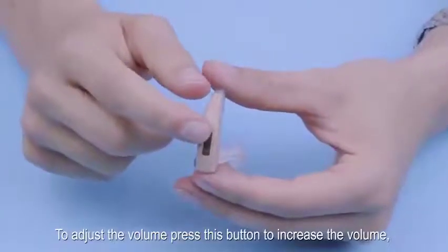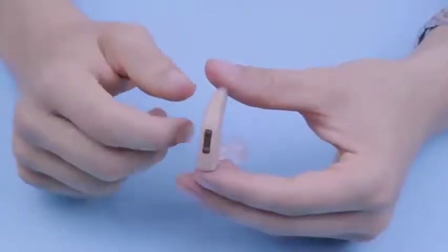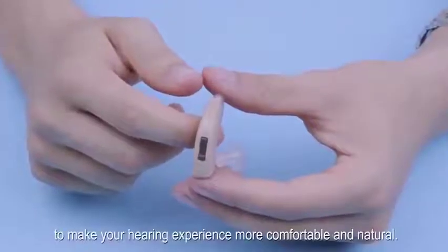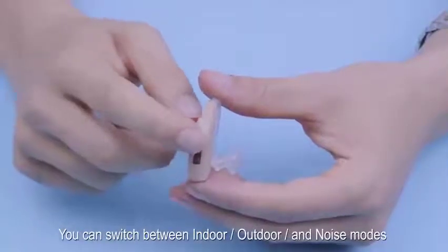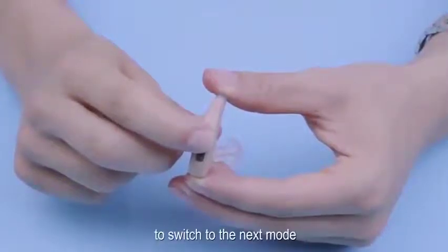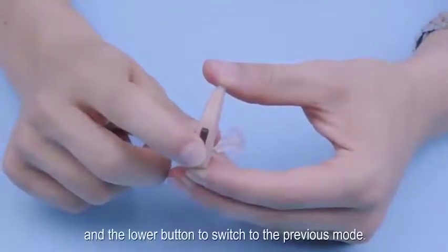To adjust the volume, press this button to increase the volume and this button to decrease the volume. Your hearing aid has 3 different modes to make your hearing experience more comfortable and natural. You can switch between indoor, outdoor, and noise modes by holding down the top button for 10 seconds to switch to the next mode, and the lower button to switch to the previous mode.